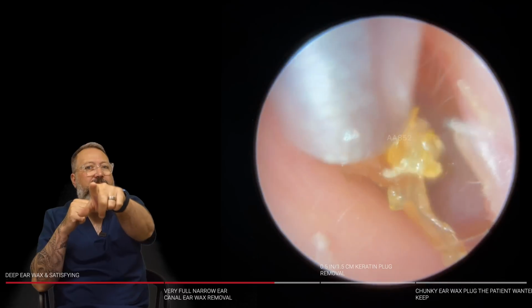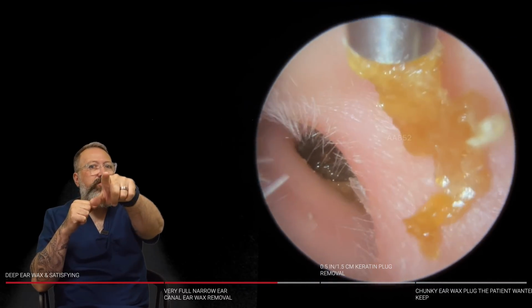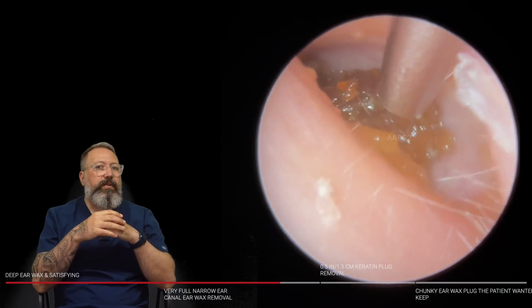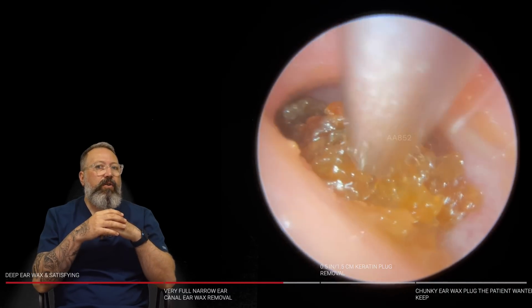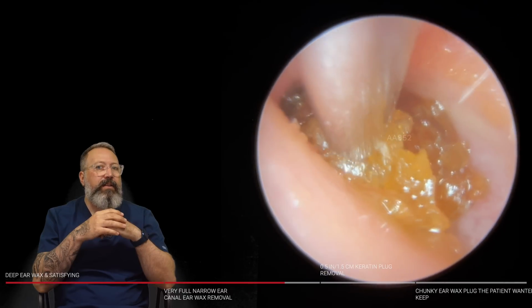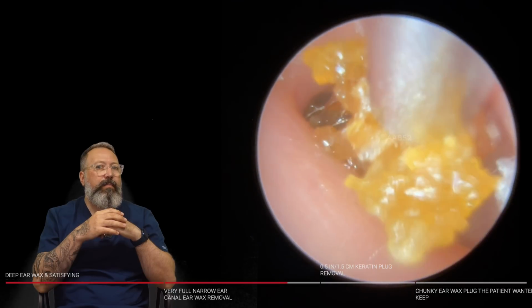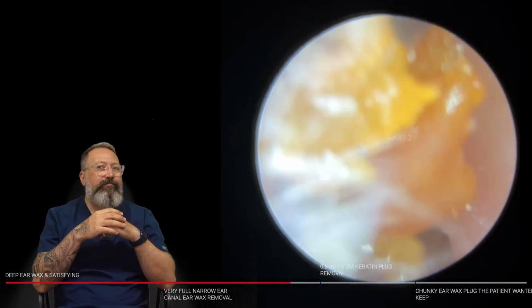Oh, now watch this keratin now. Look at this. So you've got that keratin strip there. That's an indication there is some keratin in here as well. So let's have a little look. We can see there's a lot left in here, but if we can get a hold of that ribbon of keratin again, and it holds, watch what will happen. Look at it. There you go.